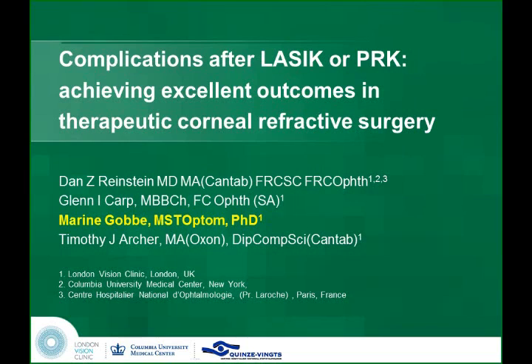With the Zeiss system, the refractive accuracy of the topography-guided treatments is unbelievably high. We really don't expect to need to do enhancements more than 5 or 10% of the time with the Zeiss topography-guided system, with the MEL80. So the answer is no, it's not going to be more tissue because of the enhancement, and I believe that wavefront-guided enhancements are equally unlikely to reach target with the machine that you're probably thinking about, because they don't have internal algorithms that measure the influence of the higher orders on the refraction of the patient.